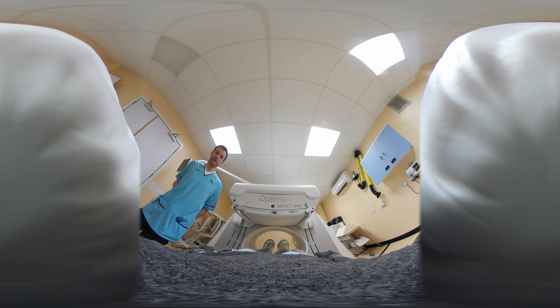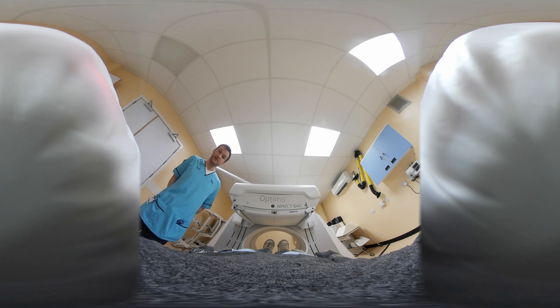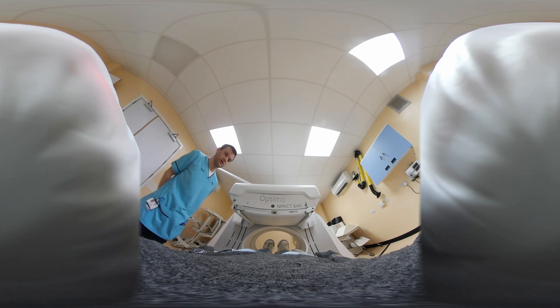You're on the camera table right now. We're just going to move you in underneath the camera heads here, the detectors, and then after a little period of time they're going to come down quite close to the face, and we'll start the scan, and you will gradually move out as the scan has been completed. Okay, here we go.